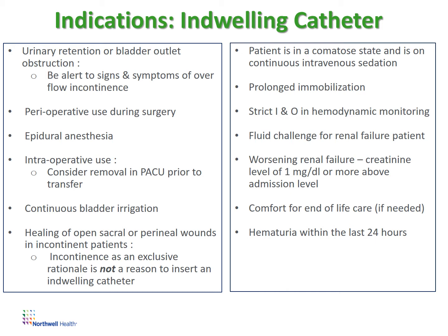If the Foley is not removed, it should be reviewed again before the patient moves from the PACU to the floor. If the patient is going to experience a prolonged immobilization or if they're in a comatose state, you may also see an order for an indwelling urinary catheter. For our renal patients, we could use catheters for fluid challenges, or if the patient's creatinine is 1 milligram or more above the baseline admission level, the doctor may order an indwelling catheter.